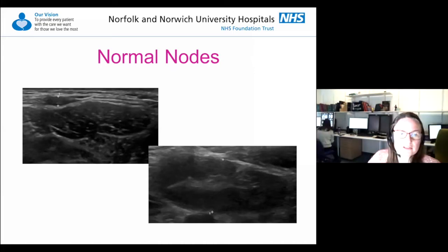This is only 2 millimeters in short axis. Often they sit on top of the sternocleidomastoid, and the patients turn the neck and tense the muscle and can feel this tiny node, and often they get referred up on 2-week waits. So it's not necessarily a good use of resources. Sometimes we're struggling to find them when they're referred as well, which can be a bit frustrating from our point of view, with these tiny nodes that are barely palpable. And every list I have something like this.